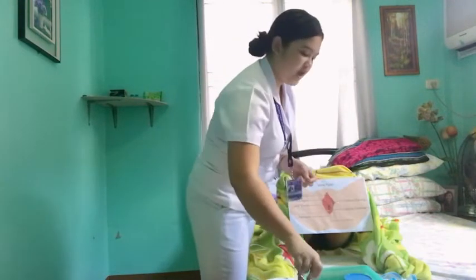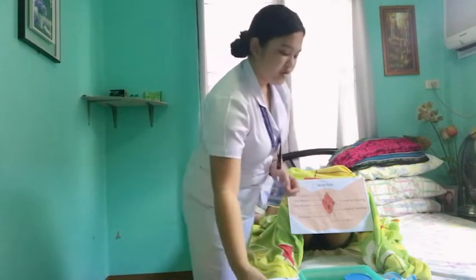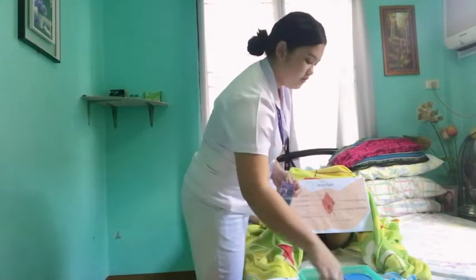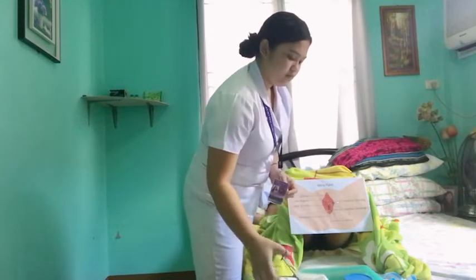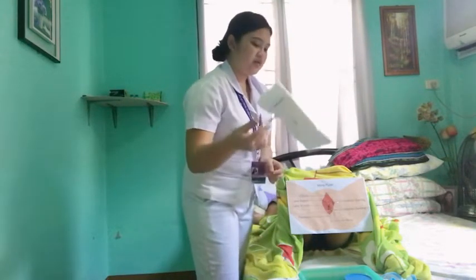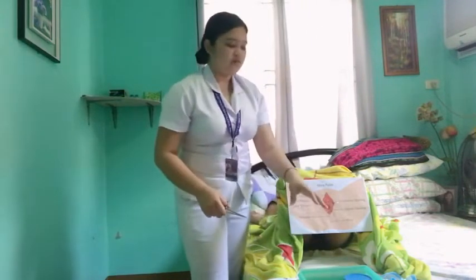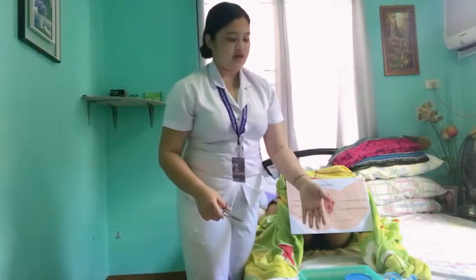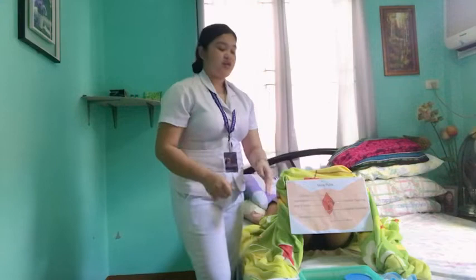Then we have our eye sheet, sterile gloves, and the cotton balls, betadine, and already filled injection with 10 cc sterile water.